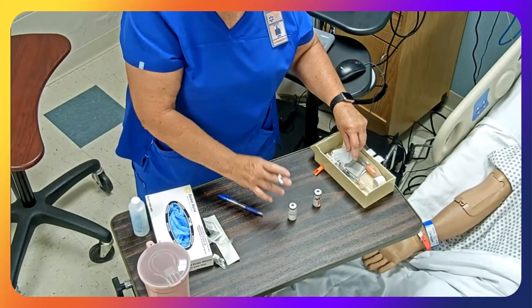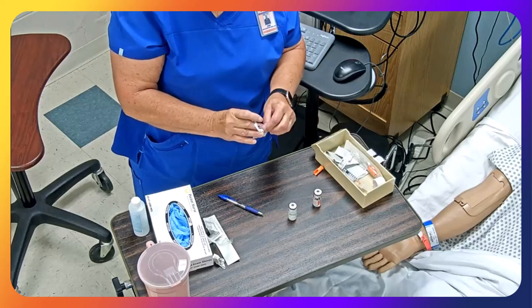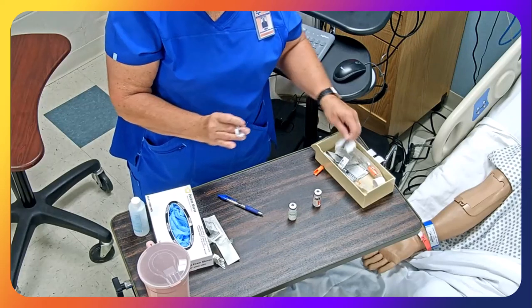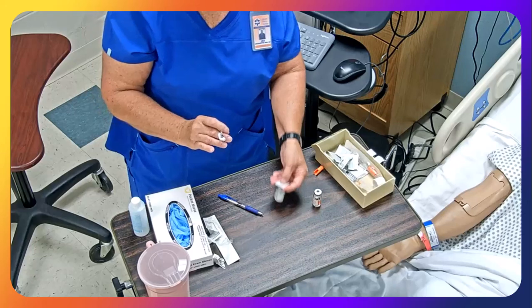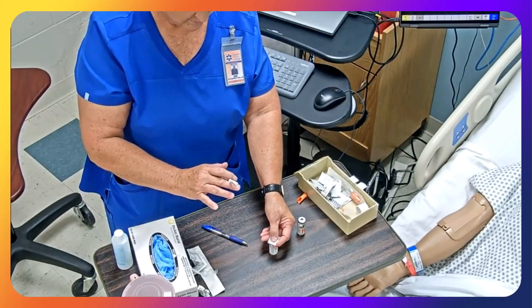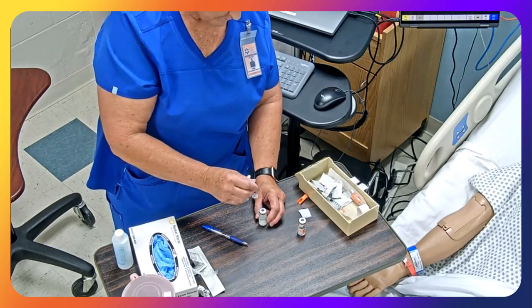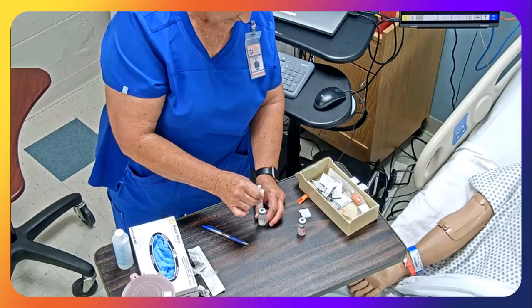Because I've probably been crossing over that, I'm going to re-clean that again. So we're going to be giving the 12 units. So 8 plus 12 is 20. So I've already put the 12 units in.